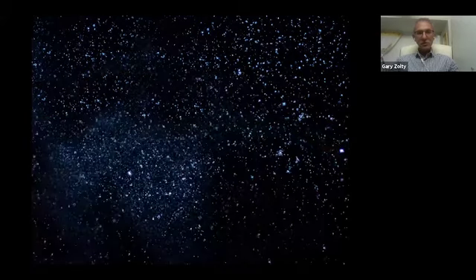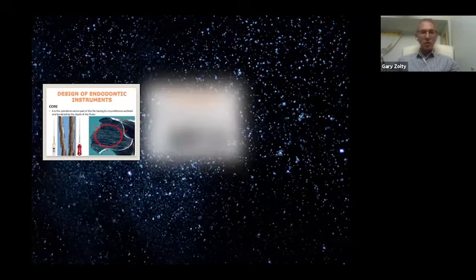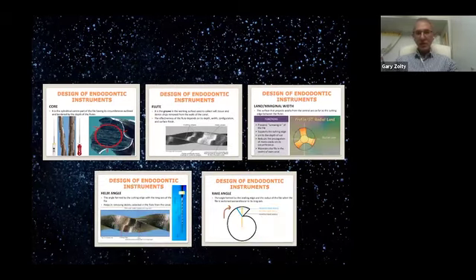Just a visual part of what it looks like. So there's the core on the left, then the flute, that's the groove between the cutting edge, the land, and the helix angle, and the rake angle. So we have a close look at your file systems.